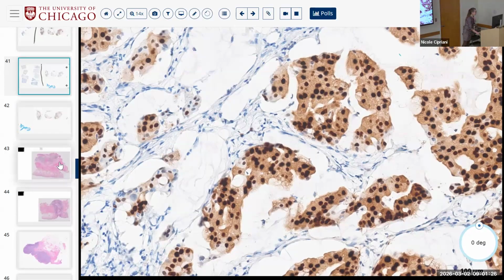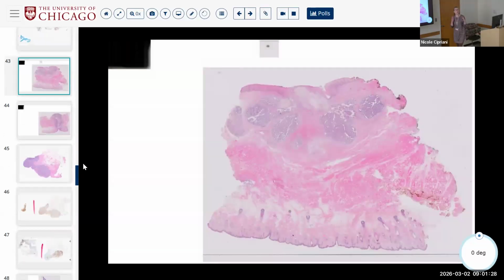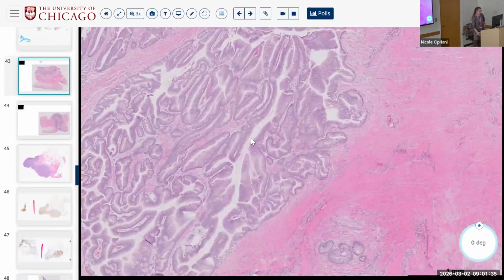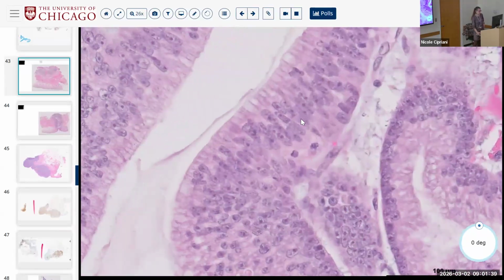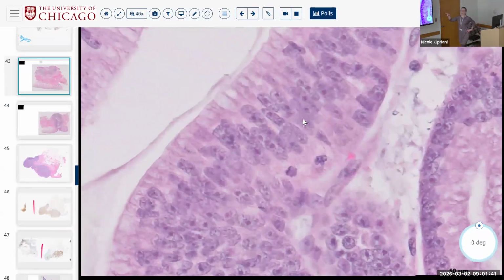Another example of the exact same diagnosis of mucinous adenocarcinoma is one that looks very papillary cystic and has these cells with giant red nucleoli that was NKX 3.1 positive, right? It was like, oh, is this a metastatic prostate cancer, because of those cherry nucleoli and the NKX 3.1.